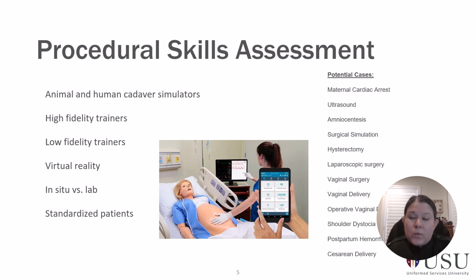These are obviously quite realistic, being that they're using actual tissue, but certainly can have cost and ethical considerations. There are many high fidelity trainers on the market. We'll go over a few of the different options that are available. Certainly, these can carry a high price tag and may not be entirely necessary based on what you're trying to train or achieve. And then there are many low fidelity trainers.